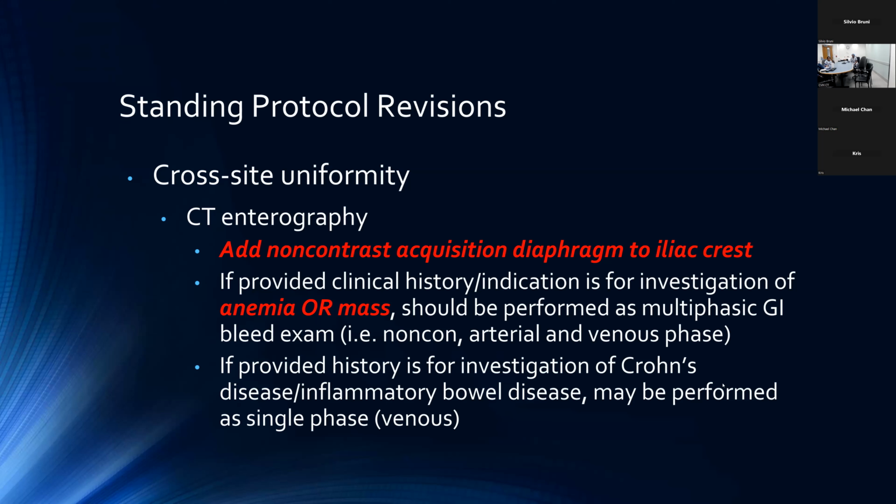Those patients are frequent flyers in terms of imaging. They get repeat CTs throughout their lifetime. So wherever we can save the radiation dose for those frequent flyers, it's ideal. So those are the main reasons that we do those exams as a single phase study, and really doesn't add a ton more information doing the multi-phase.